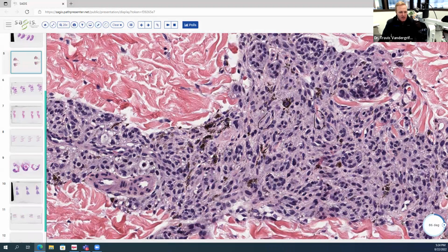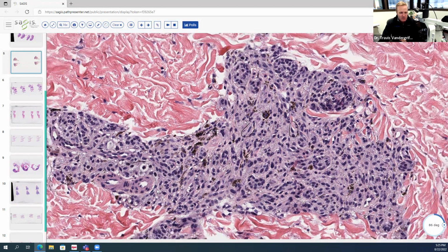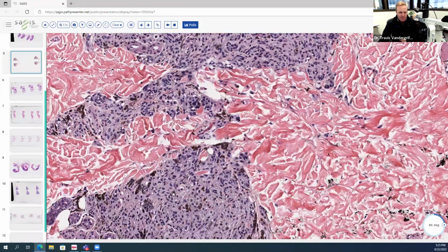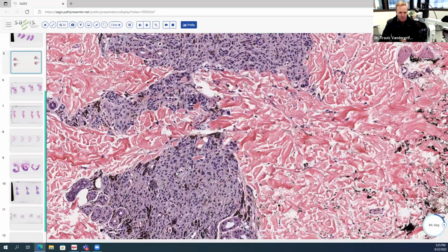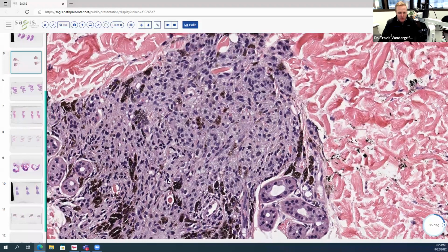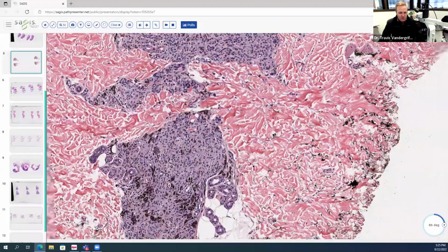So we'll see these spindle shaped melanocytes, and then some that are more epithelioid or round. The cytoplasm of a deep penetrating nevus cell, a DPN cell, is a foamy gray cytoplasm that tends to have really tiny melanin particles in it, what's called finely divided or dusty melanin. And those cells are typical of a deep penetrating nevus. And you'll see them at the bottom part of a deep penetrating nevus, where it becomes this bulbous wedge-shaped growth.